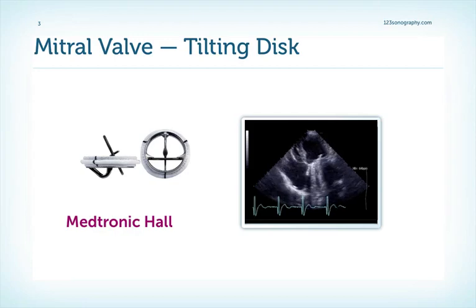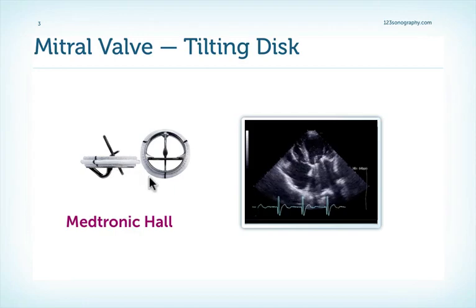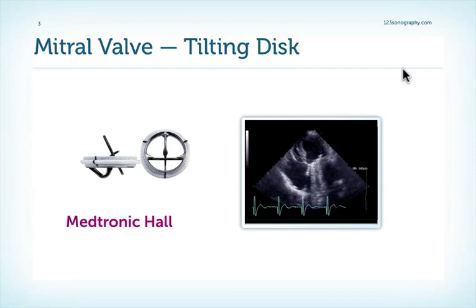First, here is a tilting disc valve. Remember, we only have one disc, which is asymmetrically positioned. We have two orifices, one here which is smaller, and another one which is larger. Here is the corresponding echo of a patient who has such a Medtronic Hall valve.